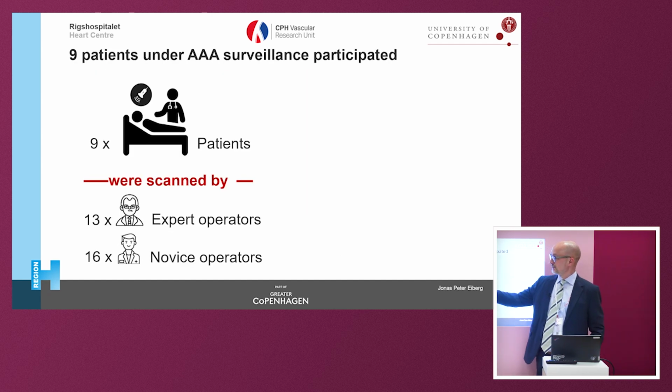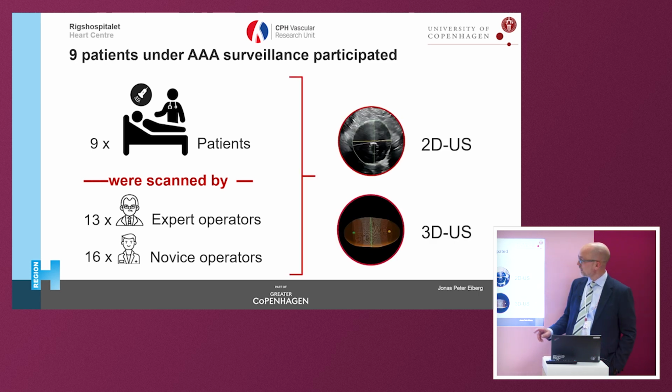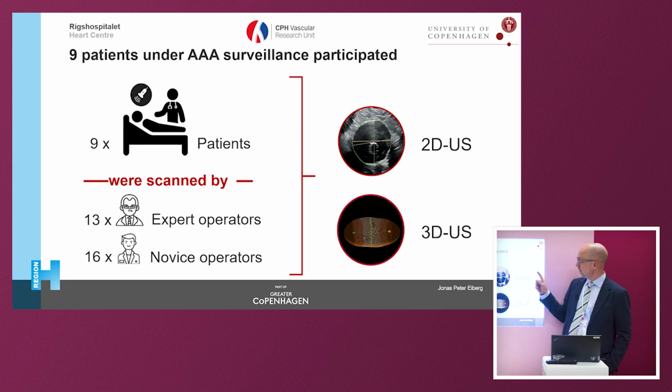So we recruited 9 patients. They were very patient because they were scanned. Each patient was scanned by 13 experts and 16 novices. And all operators were asked to do a 2D ultrasound and a 3D ultrasound.